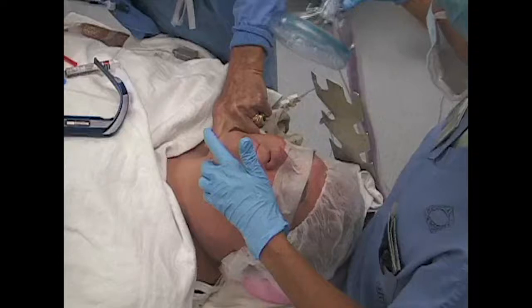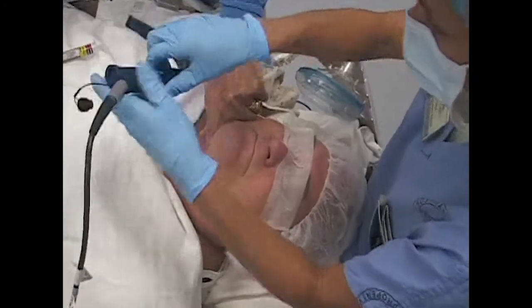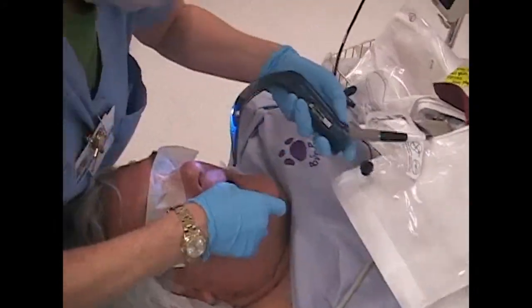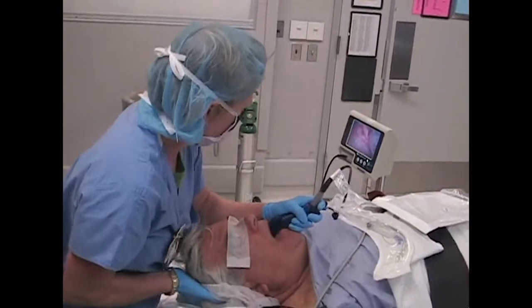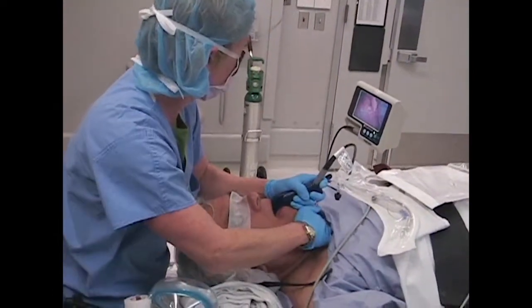Let's start by reviewing use of the GlideScope in an adult. The GlideScope video laryngoscope is an extremely useful tool for intubating the patient with a challenging airway, because it allows the intubator to essentially see around the corner into the posterior pharynx. This image is then projected on a monitor where not only the intubator, but his or her assistants can see it.